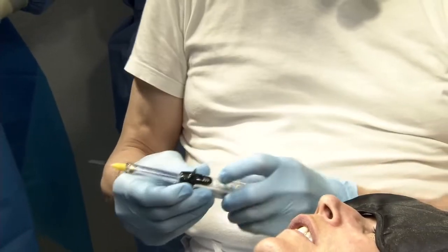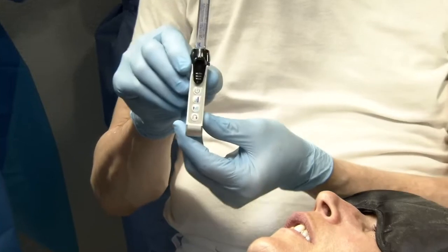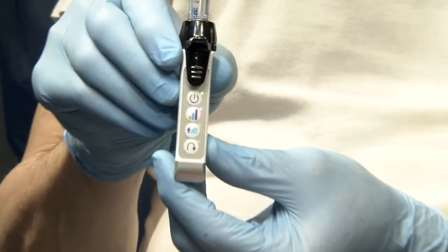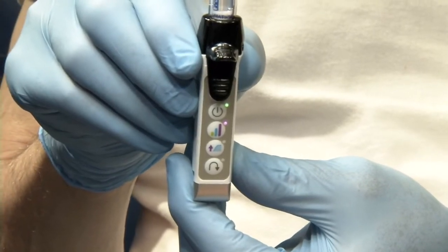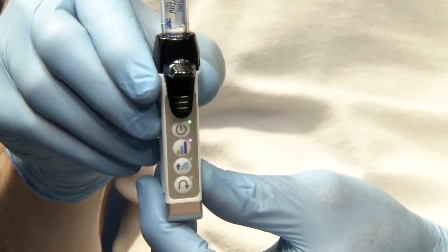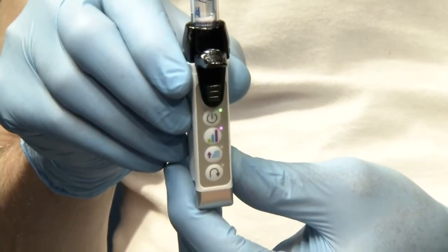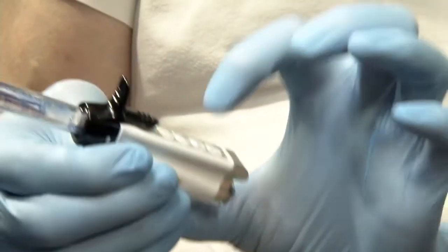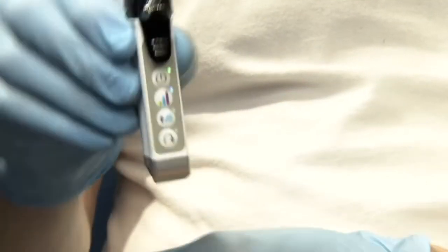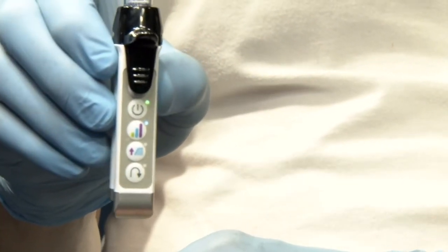What you do is the following: you start, then you see there is a color, and the color gives you the speed of the administration of local anesthetics. If you go green, it's very slow — I use it always in the palate, very very slow. I normally press here, this is the green color. When I press another one, it goes pink or blue, and pink would be the fastest.